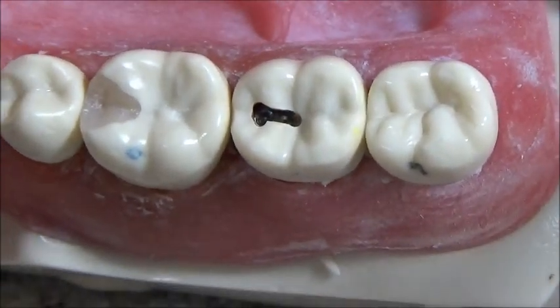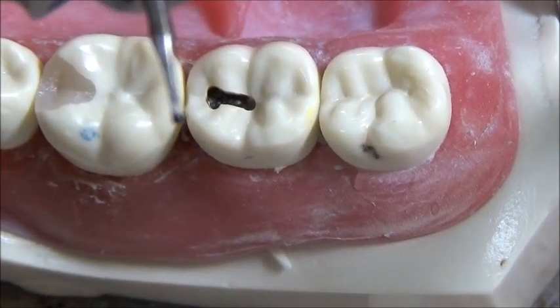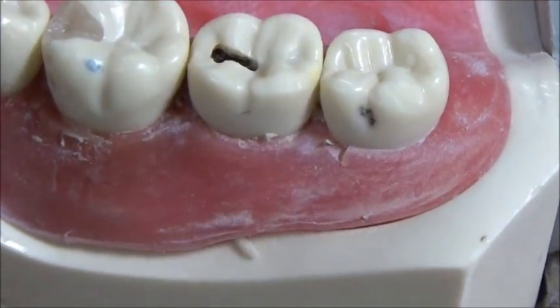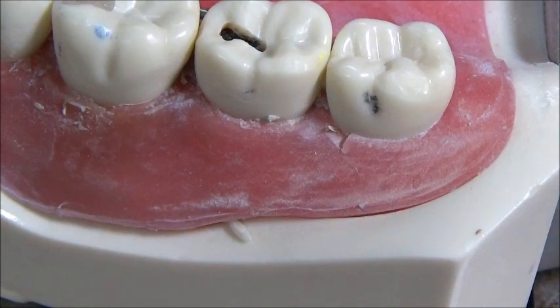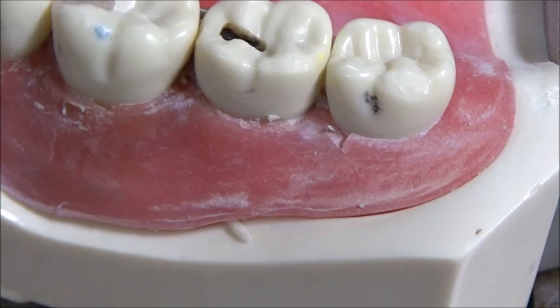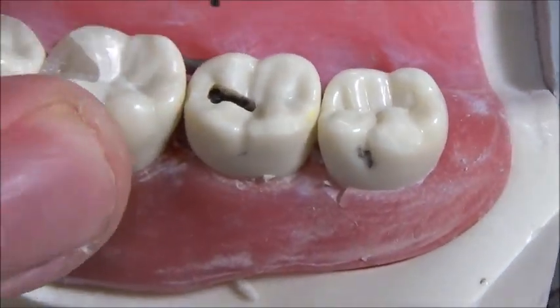You'll want to excuse the old burr — when the tip of the burr gets to this point, you'll want to replace it. I don't have the luxury of another 330, but I might go ahead and try the carbide 330. This is just called a 330 — it doesn't have the D designation because it's not diamond. Let's see if we can get a better cutting surface from this.